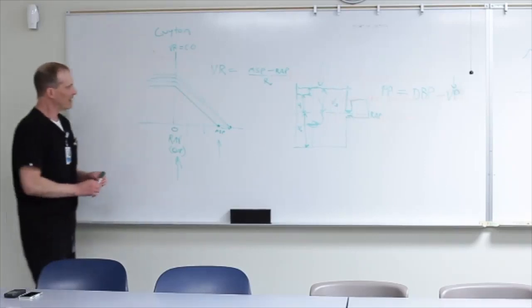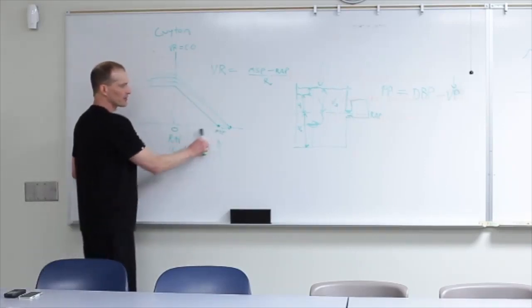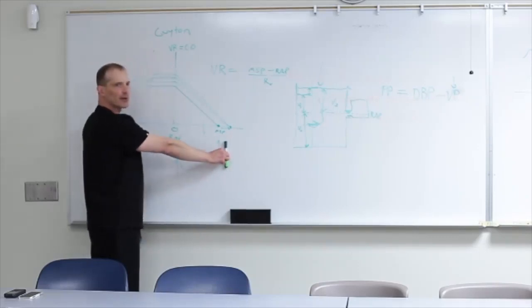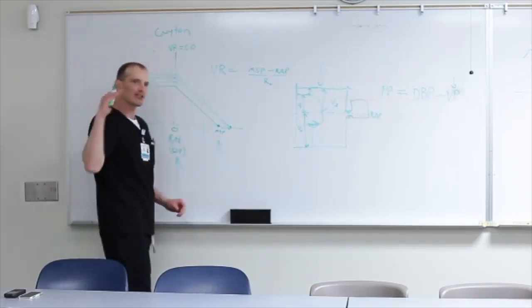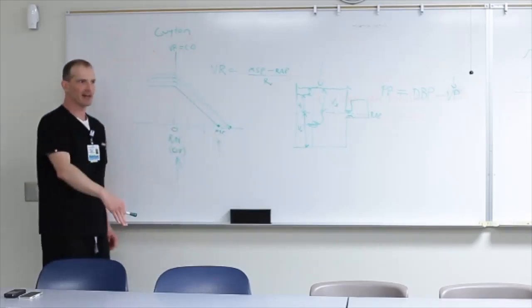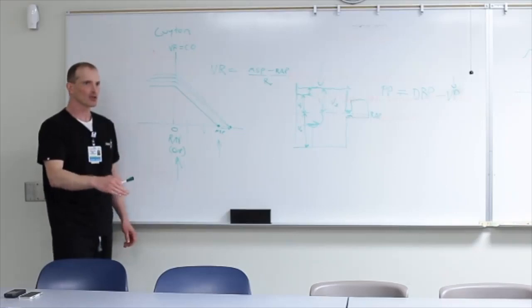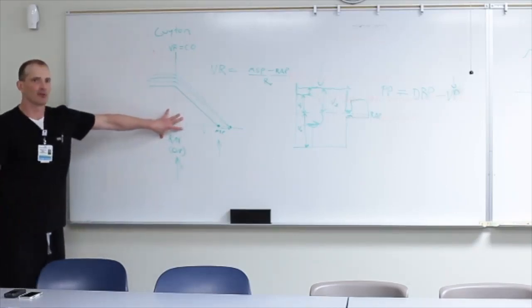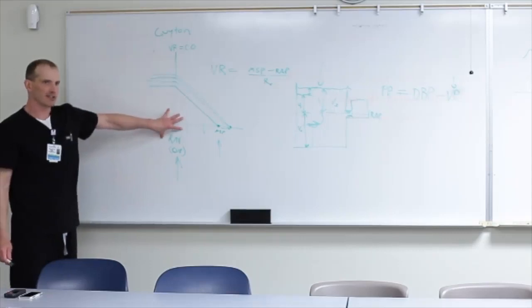However, if we're heading towards a plethoric IVC, these are high right atrial pressures, and these are low venous return states that are only going to get worse when we throw more fluids at them, okay? So what we should be talking about with the IVC, I think, is volume tolerance.